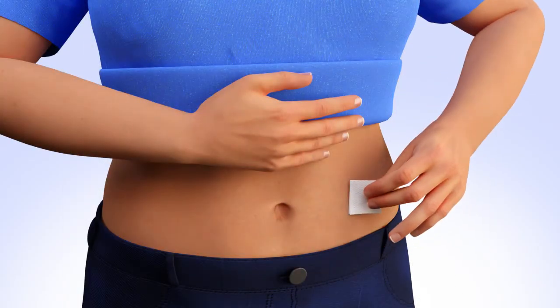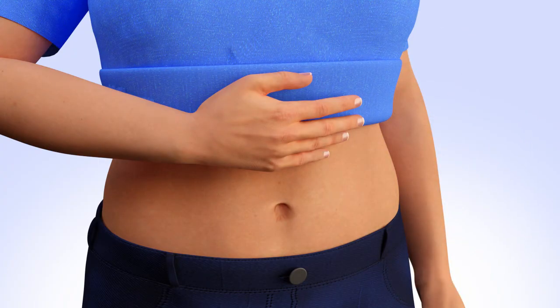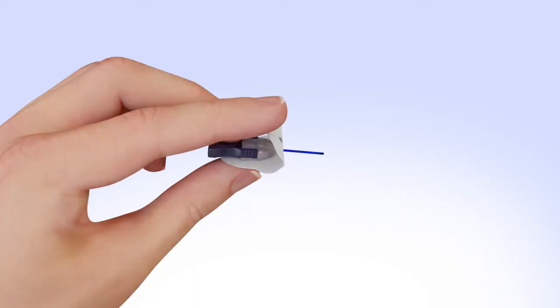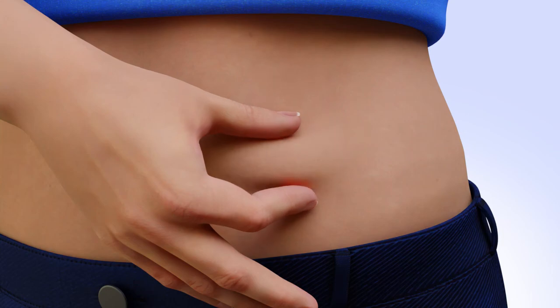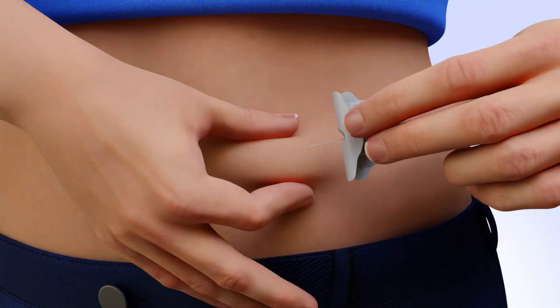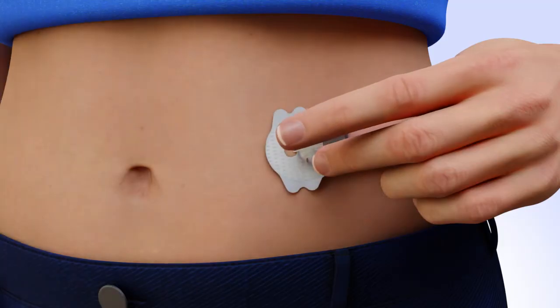Clean your infusion site properly with an alcohol wipe or prep wipe. Allow your site to air dry. Hold the insertion piece with your thumb and middle finger. With the index finger, flip the front portion of the adhesive back and hold. Remove the needle guard. With your hand, pinch the skin at the site you have prepared. Position the infusion set needle at a 20 to 45 degree angle, or as instructed by your trainer, and insert. Release the hand that is pinching the skin, continuing to hold the infusion set next to the skin.